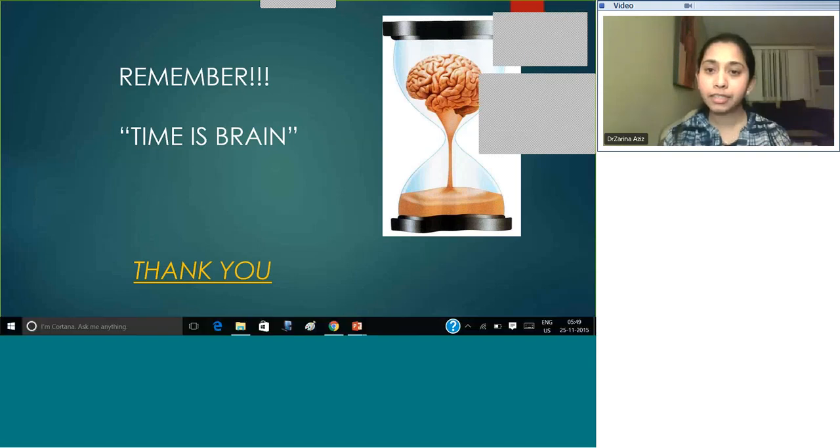Does ASPECT score potentially delay interpretation? I think it's more about getting used to ASPECT scoring. It's quite quick nowadays, and to make it easier, we are not really sticking to the exact score. We classify them broadly into good, moderate, and poor ASPECT score. So we just roughly say that anything beyond 7 is a good ASPECT score, between 4 to 7 we consider it as moderately poor, and less than 4 as very poor.